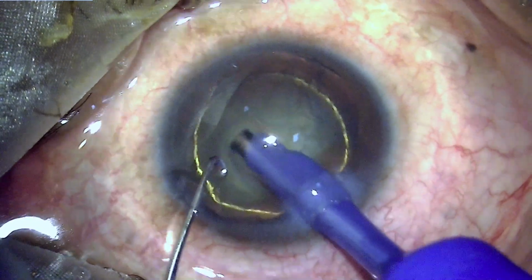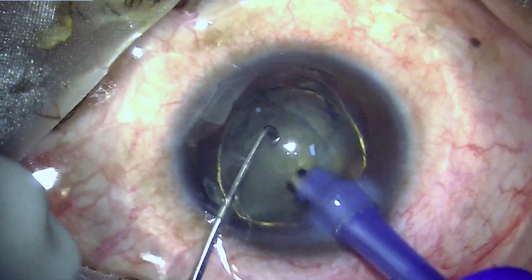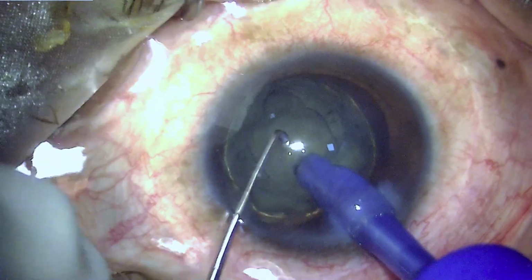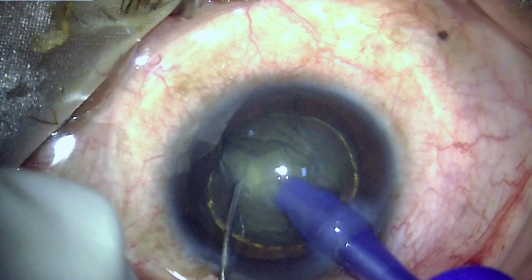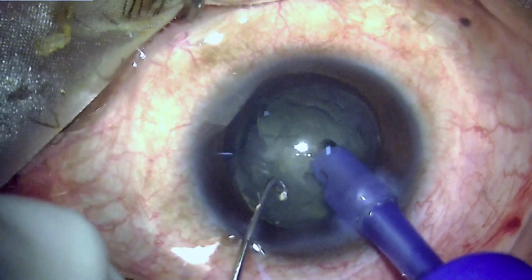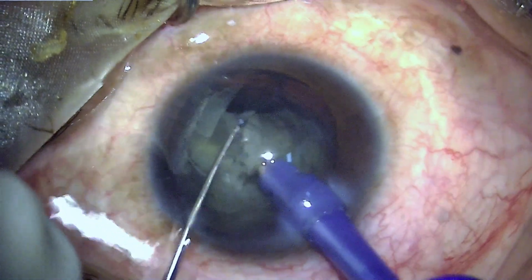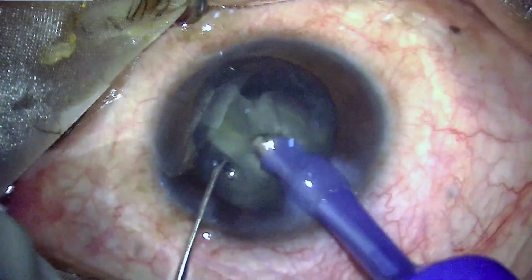So there is a nucleus which has been defined by using the hydrodelineation technique, and this is not a very large nucleus, so it can be easily chopped. So we are using a horizontal chop technique. This is a direct chop which saves a lot of ultrasound energy which is dissipated inside the eye. And once the pieces have been chopped into smaller segments, one can proceed to emulsify and consume them.